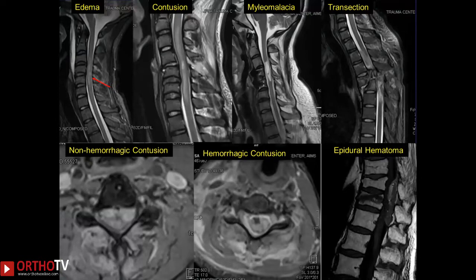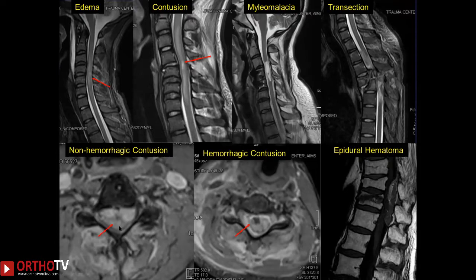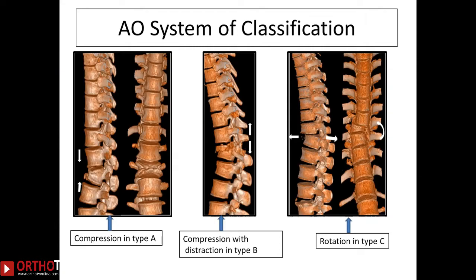The transverse ligament, when torn, is visible on MRI, as are the PLC and fracture edema. Regarding cord injuries on MRI: edema appears as a bright signal on T2 with a flame-shaped appearance; contusion is also a bright signal but confined to the site of maximum injury. Contusions can be hemorrhagic — appearing as a dark signal on T2 due to hemosiderin — or non-hemorrhagic. Cord transection is easily picked up on MRI. Over time this can result in myelomalacia, seen as a very bright signal on T2; a hematoma can be seen on T1 imaging.